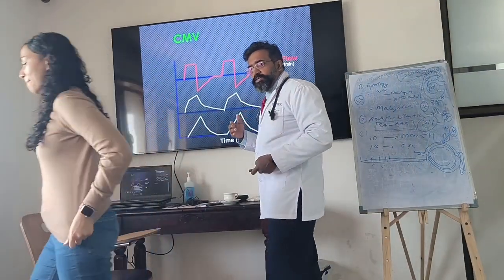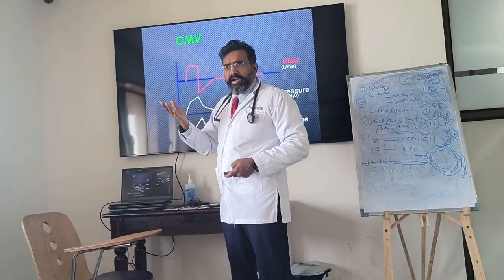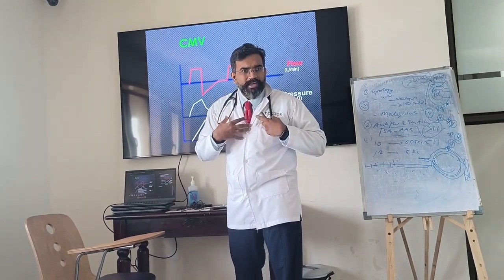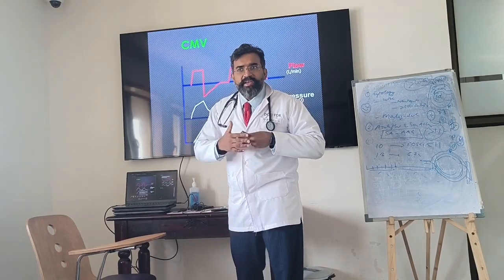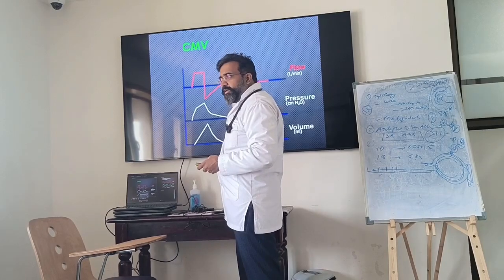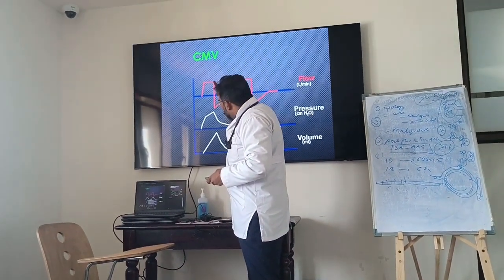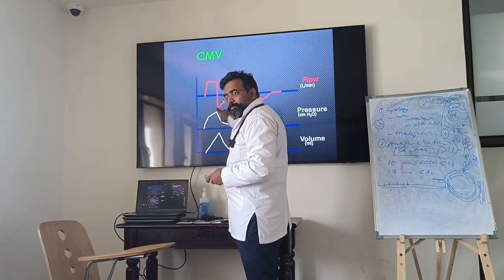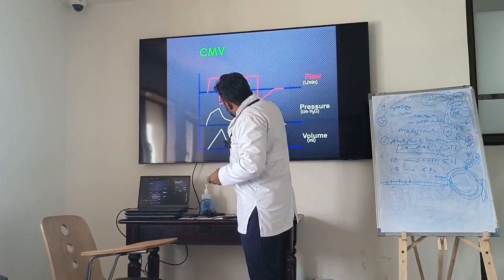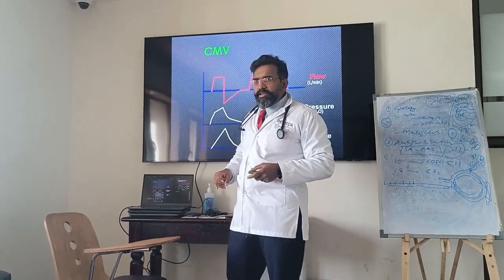Okay, so understand. Inspiration is inside, expiration is outside, right? Expiration is a passive process. Expiration is not something that I can control. Expiration is from the patient, so it will be very variable. Which is the variable thing here? Expiration. So inspiration is ending here. It is cycling here to expiration. That's how you are getting this waveform. So inspiration ends here. Now you put it down. The inspiration has ended here. Clear?